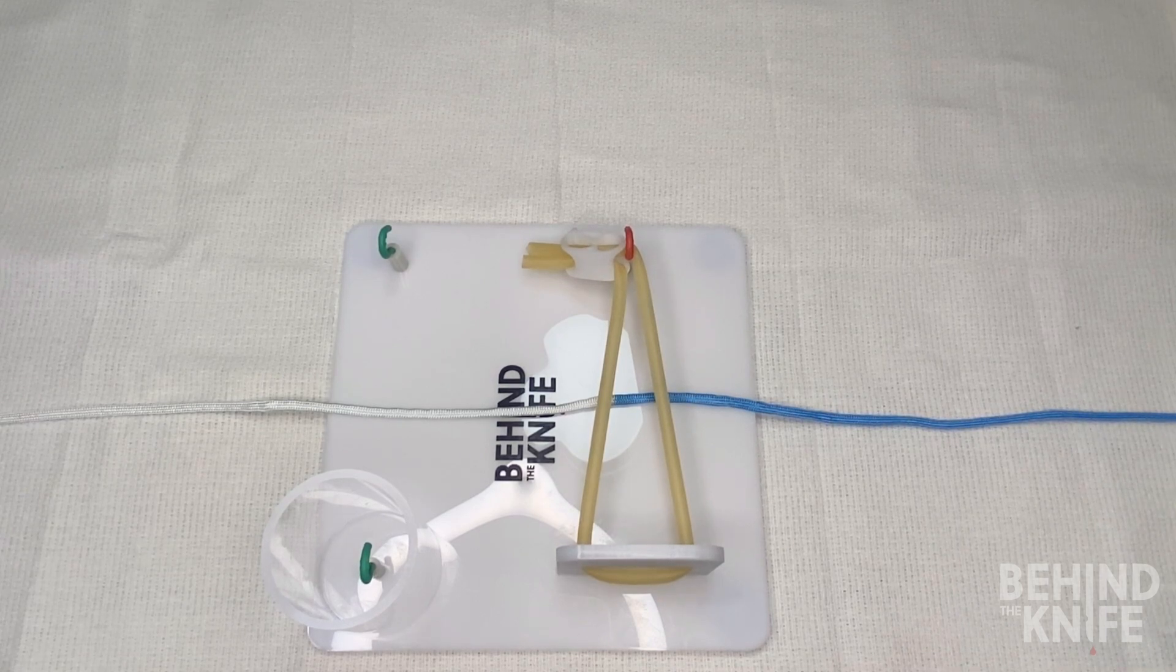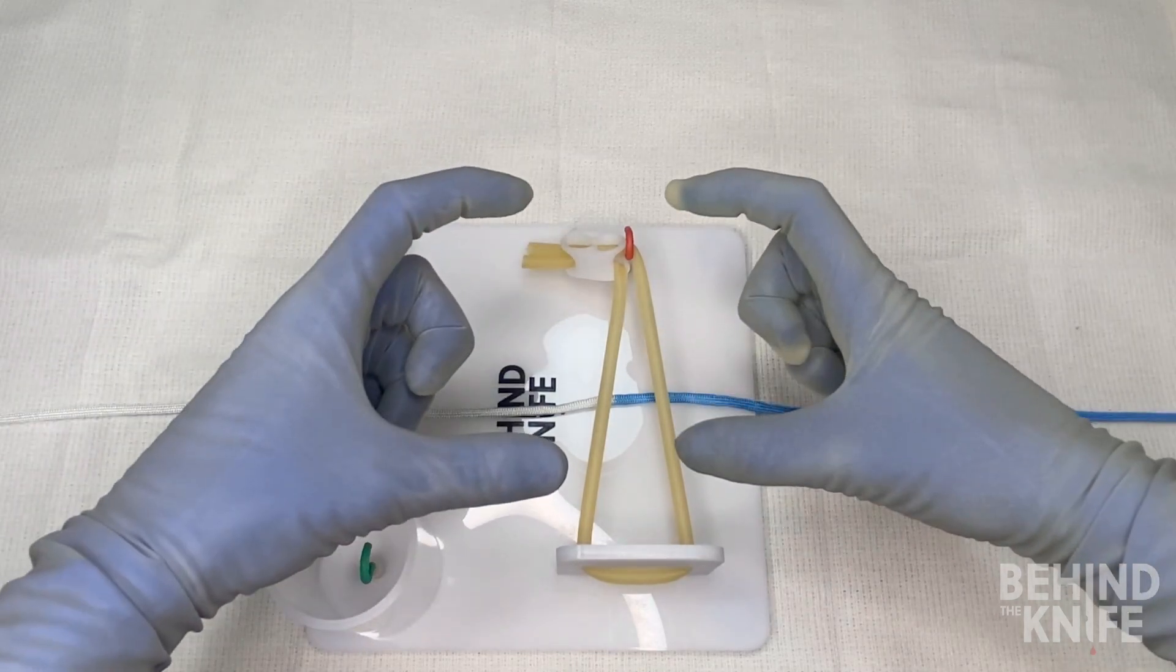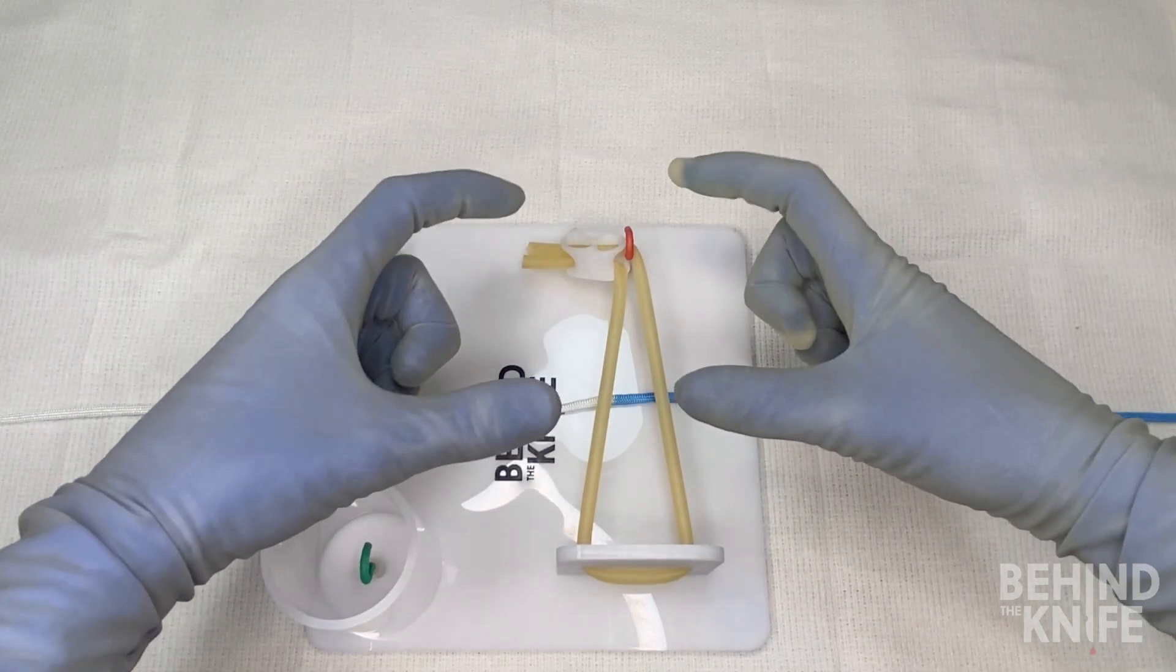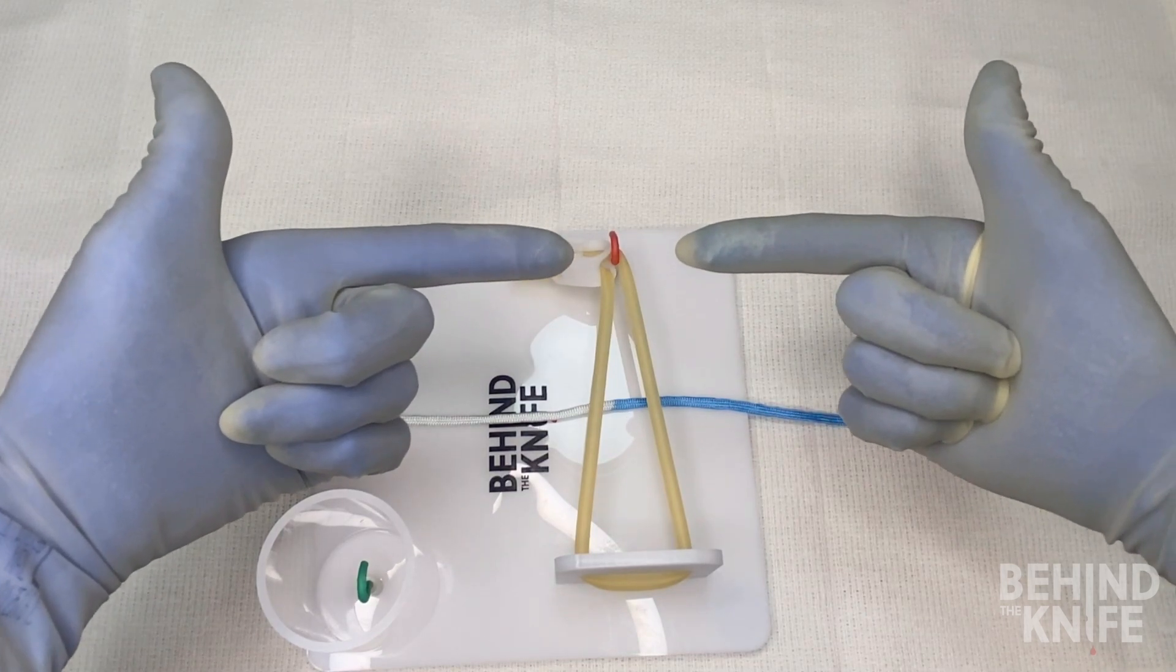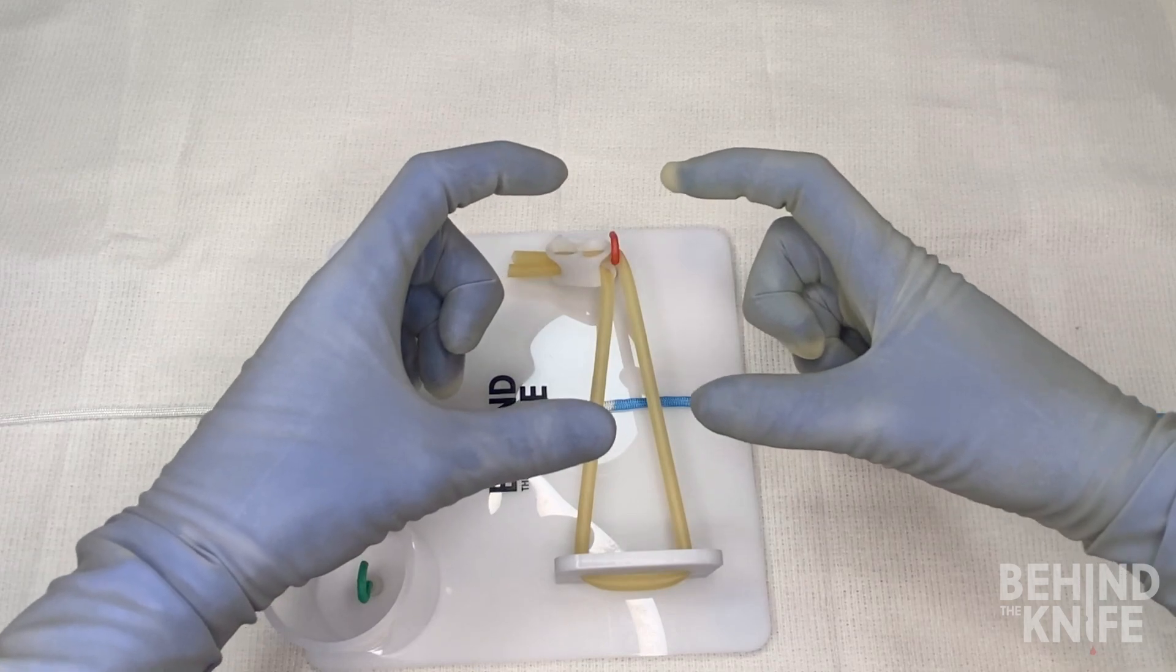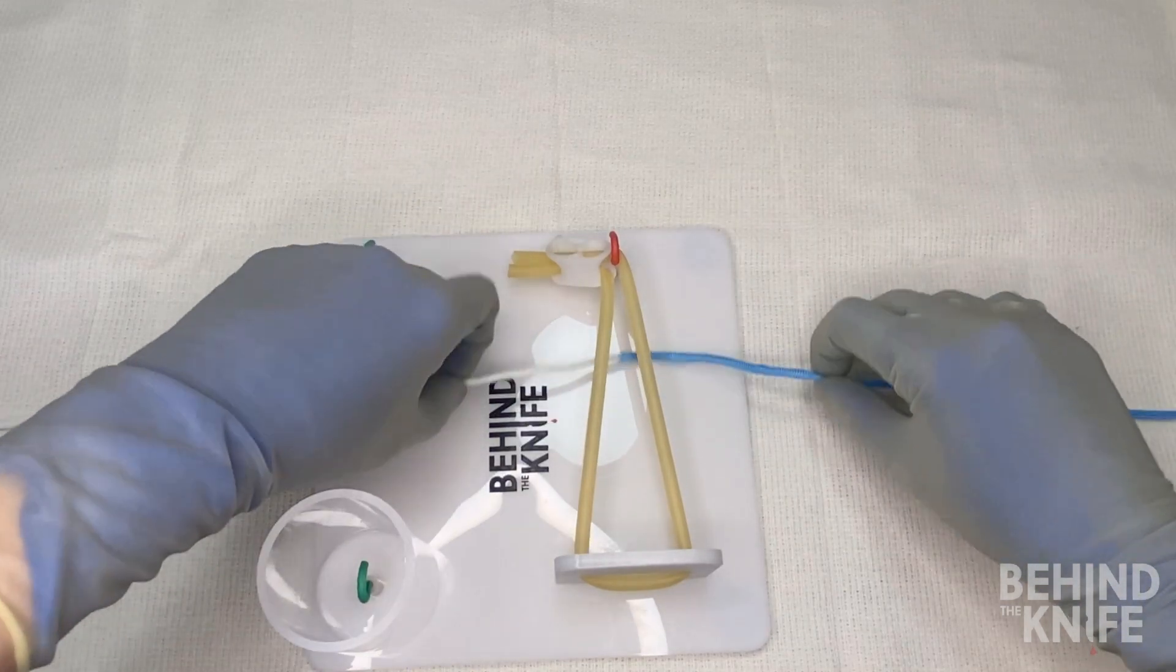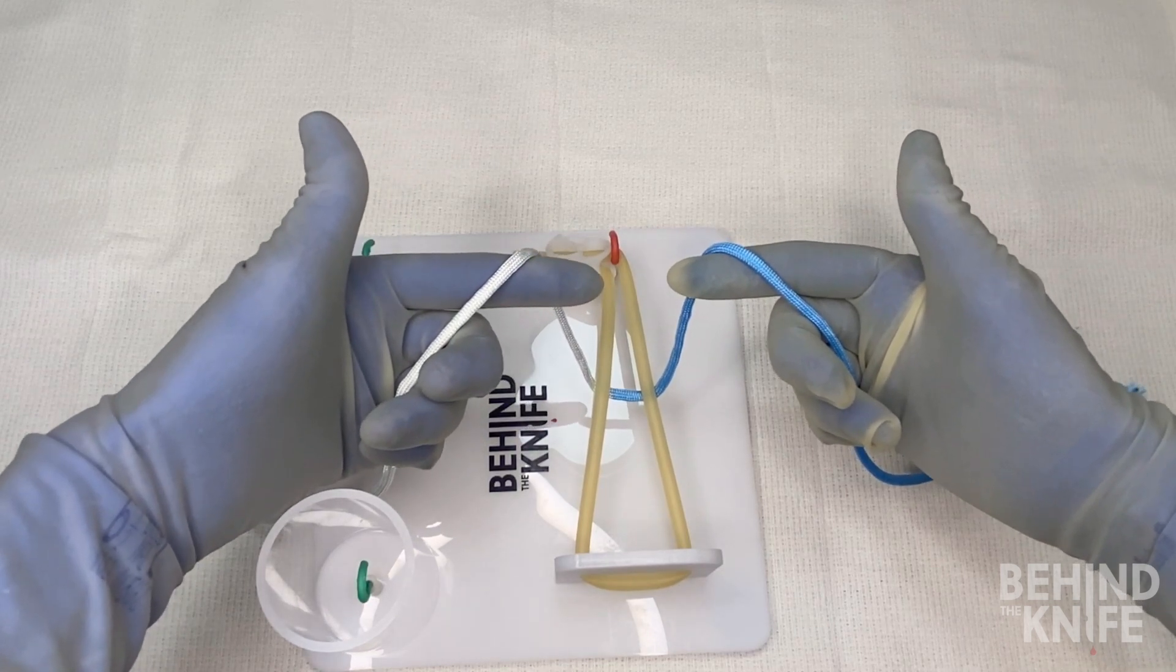Now the key to making this knot is making L's and C's with our hands, and what I mean by that is for the beginning part of this knot, we're going to make two L's with both of our hands, and when we move on to the second part, we're going to make two C's with both of our hands. So what that looks like is if we pick up our strings, the strings are going to be draped over our index fingers as such, and this is how we'll start the knot.